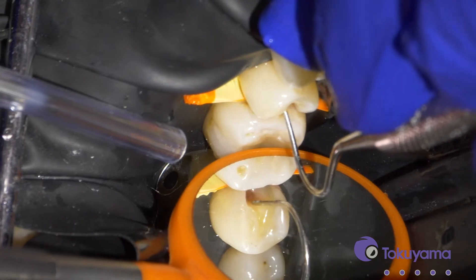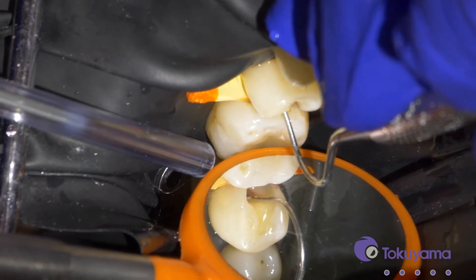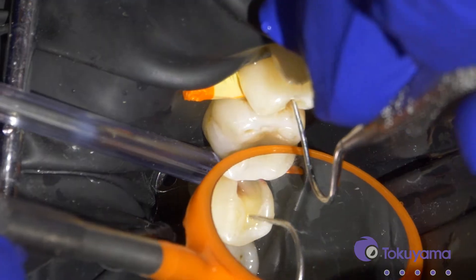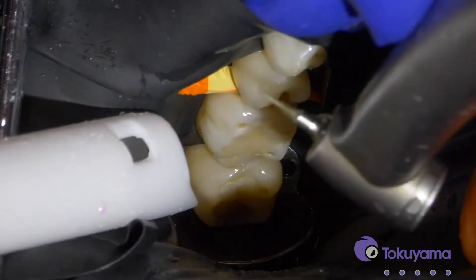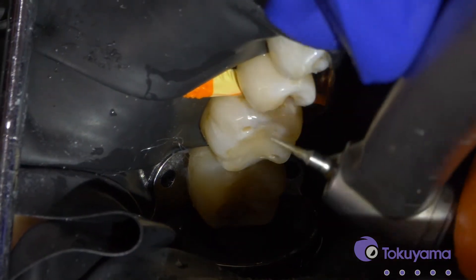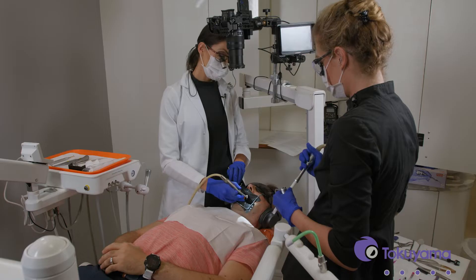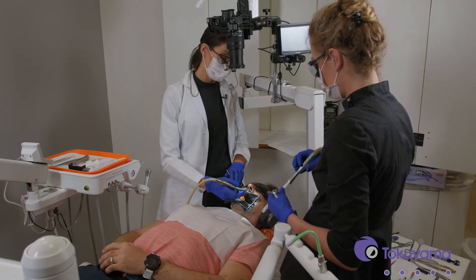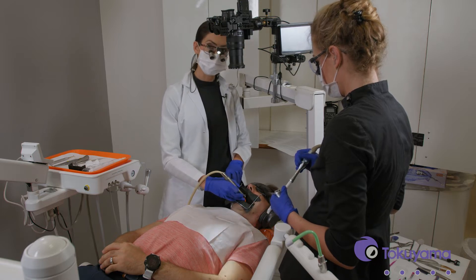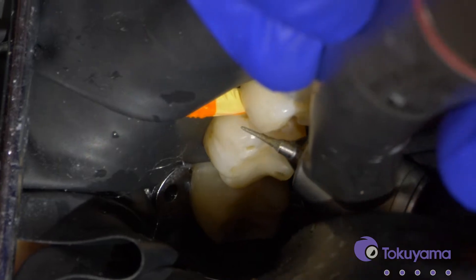There is a little bit of stain dentin in here, which is actually really good because I'm going to show you how to use the Omni Chroma blocker to get rid of that color. But I'll just smooth it out a little bit more. One thing I really like to do before I start restoring is use a mosquito borer like this, just to make sure all my contacts are clear — otherwise you can fumble with your matrix. So rather than opening up the contact of the tooth more and removing a lot of tooth, I just use that to open it up.